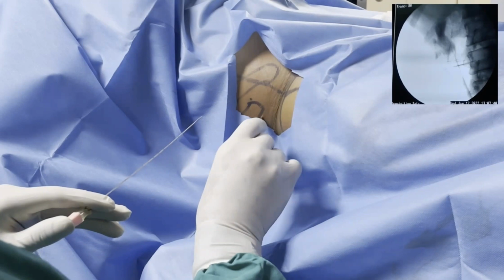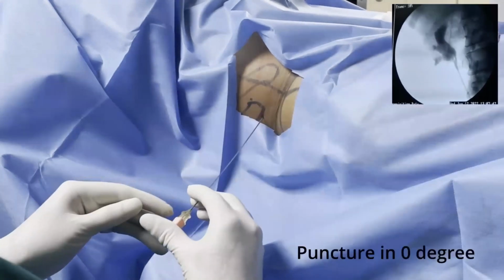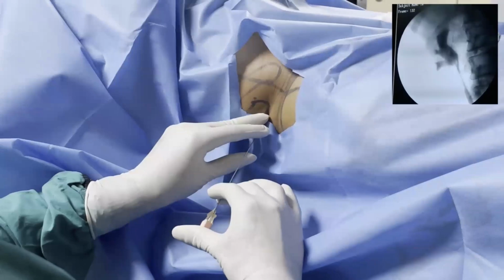First of all, the C-arm is rotated because the patient is placed in a 20-degree flank up position. So we usually do minus 20 degrees of the C-arm, instead of putting the C-arm on our side, so that the kidney lies in the 0 degree. So first, after doing a pyelogram, we select the calyx, and then the calyx is punctured under 0 degree first. We have selected the lower calyx, and then we will be puncturing the lower calyx.